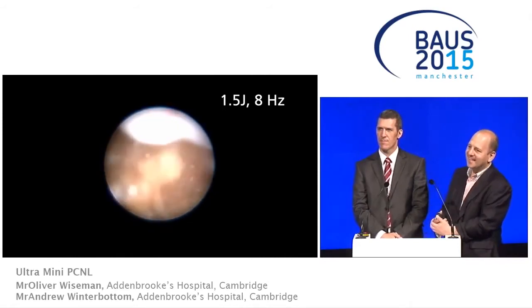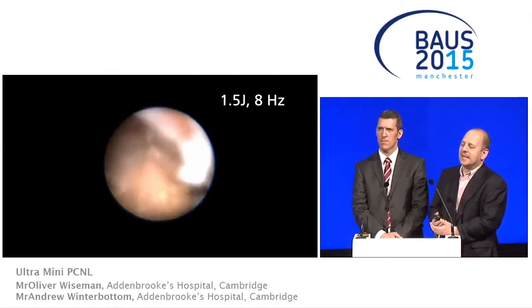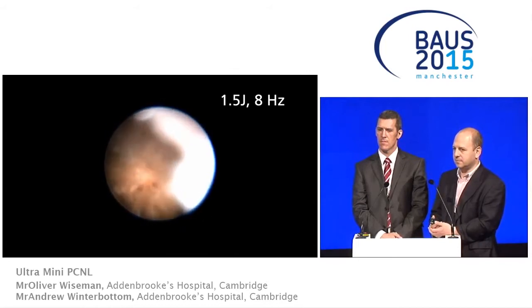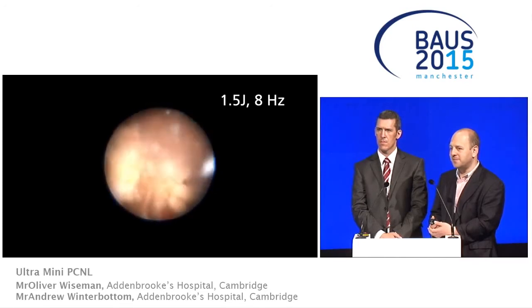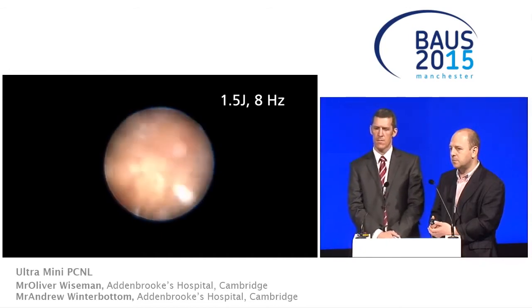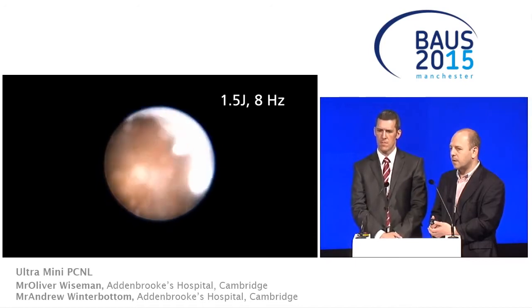We've done a few of these too, and as you know, I'm very much a 2-wire person rather than a 1-wire, and having a wire outside gives me some reassurance. We use a dual lumen catheter for having a wire outside because the one in does get in the way. We're watching this quite relaxing, really, watching as live surgery that's already happened. But all of these fragments that are in the renal pelvis, are you concerned about washing those elsewhere in the kidney? Because sometimes it's a bit more difficult to look around with an Ultra Mini. What's your technique for those?